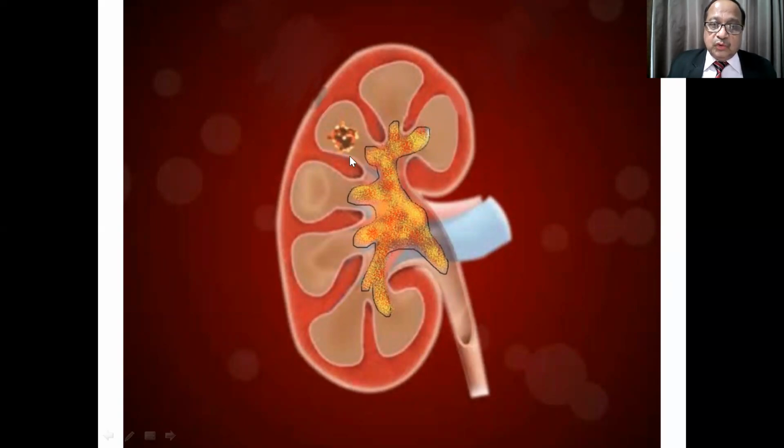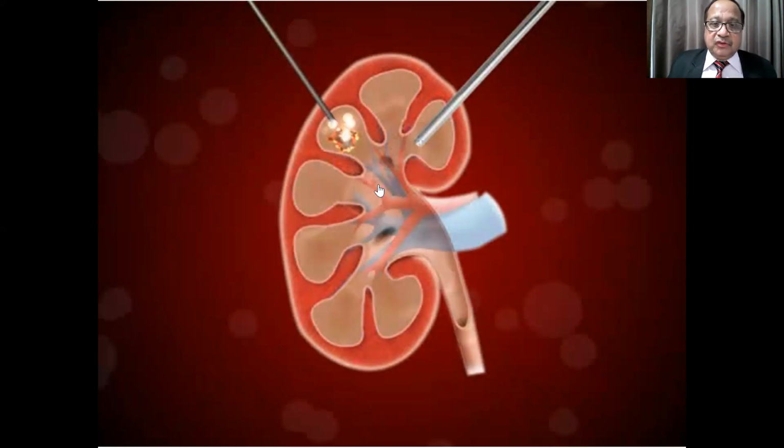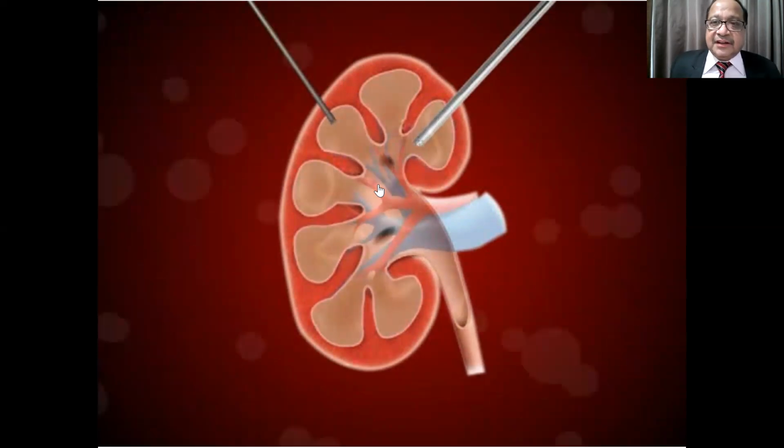Now, this infundibulum is usually wide in these cases. Once you have removed this staghorn through this particular Amplatz sheath, and this is the remaining fragment or remaining stone, there is no need to make another track or pass a flexible nephroscope and spend some time or do any other ancillary procedure. Just pass an initial puncture needle on the lateral aspect of the stone and give a saline push through this needle. Once you push saline through this needle, this particular stone will come in front of you, and then you can pick up this stone and remove it from the same track. So this is the technique of saline jet, and you will be able to remove most of the partial staghorn stones completely through a single track.